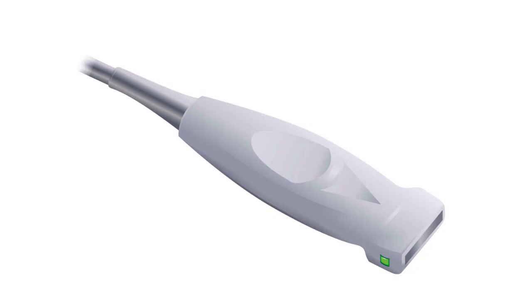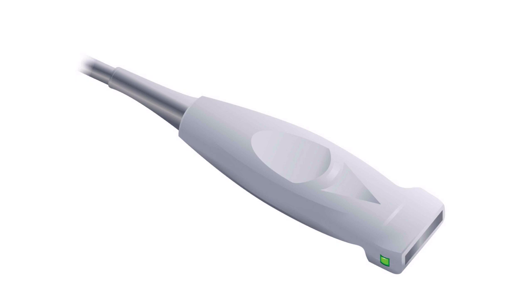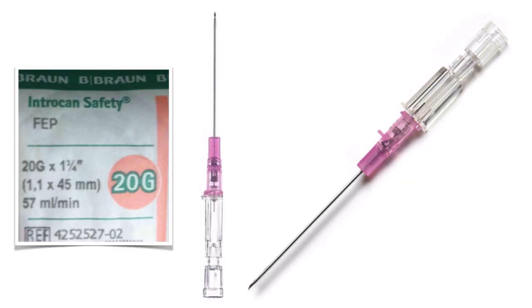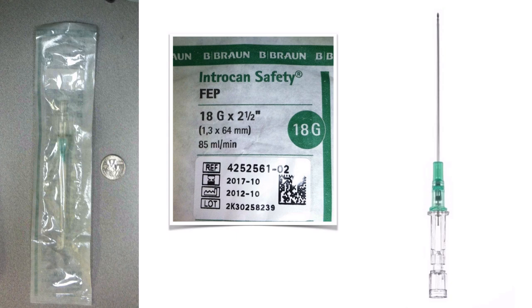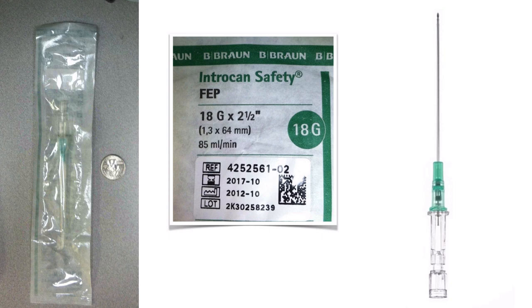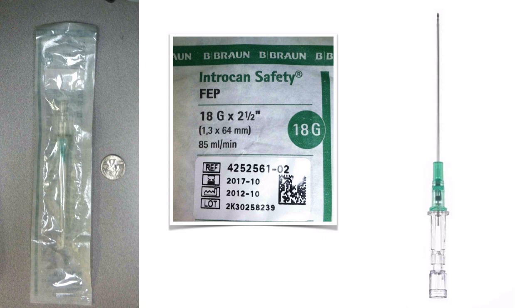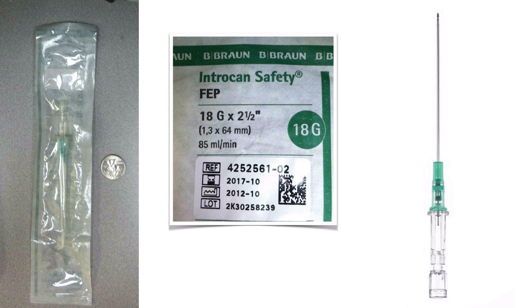The linear array probe offers the highest resolution and best image for vessel localization and needle visualization during catheterization. You'll most commonly use a catheter-over-needle system, which is generally slightly longer than standard landmark IV catheters to ensure catheter seating and prevent extravasation. For example, a 20-gauge 1.75-inch (45 mm) catheter or an 18-gauge 2.5-inch (64 mm) catheter. Catheter length determines how deep a vessel you can access, and gauge determines flow rate for fluid resuscitation, medication administration, or power injection.